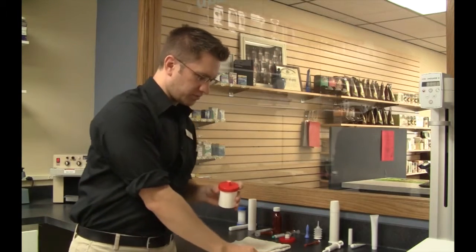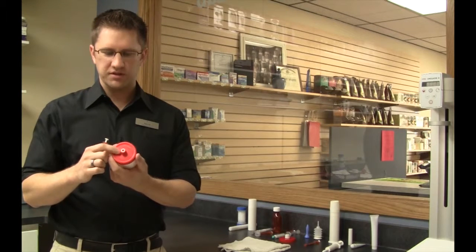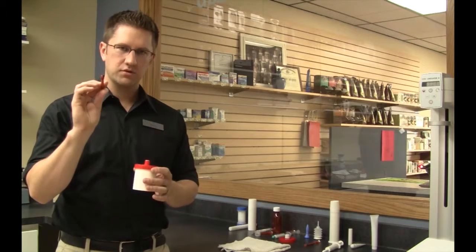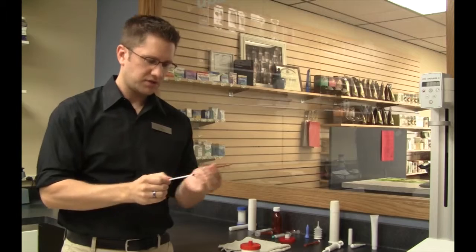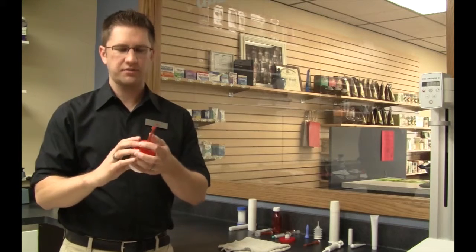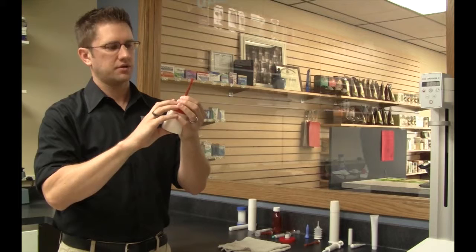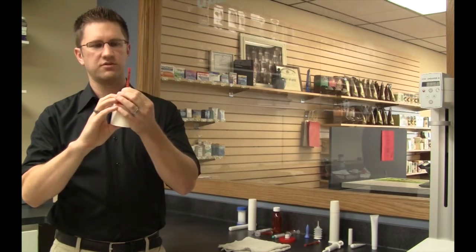Sometimes if you want a pre-dispensed or pre-measured amount of cream, we can also place an EMP insert into the jar. We'll give you a little syringe that looks like this. In order to use it, you'll have to pull off the syringe, pull it out, place it into the adapter, and you'll press up on the bottom of the jar. You press up on the bottom of the jar to fill your syringe up to the level on which you need it.